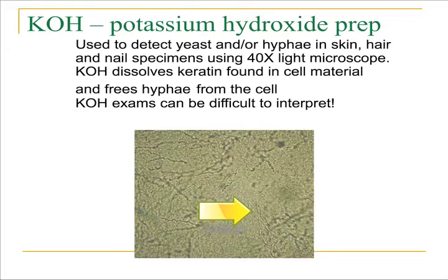If you look at the picture on this slide, you can see that it can be really difficult to differentiate the cell borders from the hyphae present on the slide. This is one of the reasons why this type of prep has kind of fallen into being not as popular as it used to be. They can be very, very difficult to interpret.